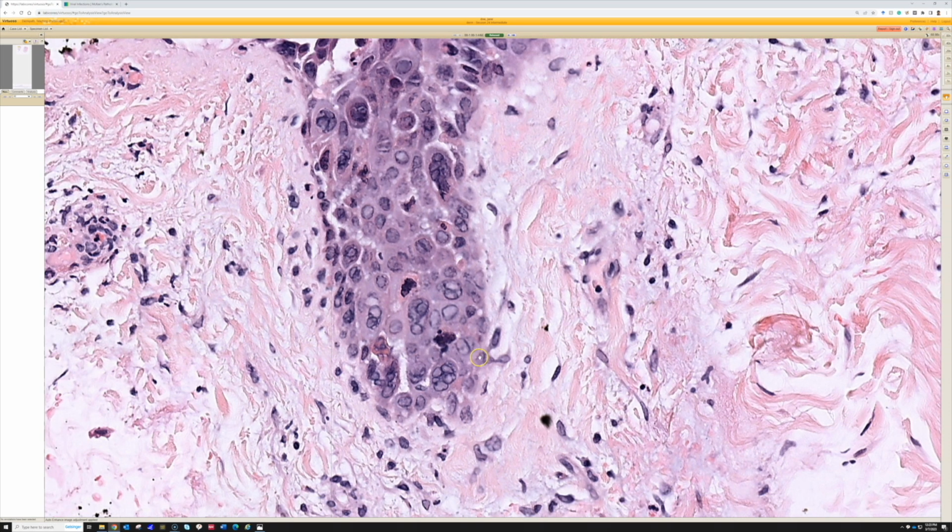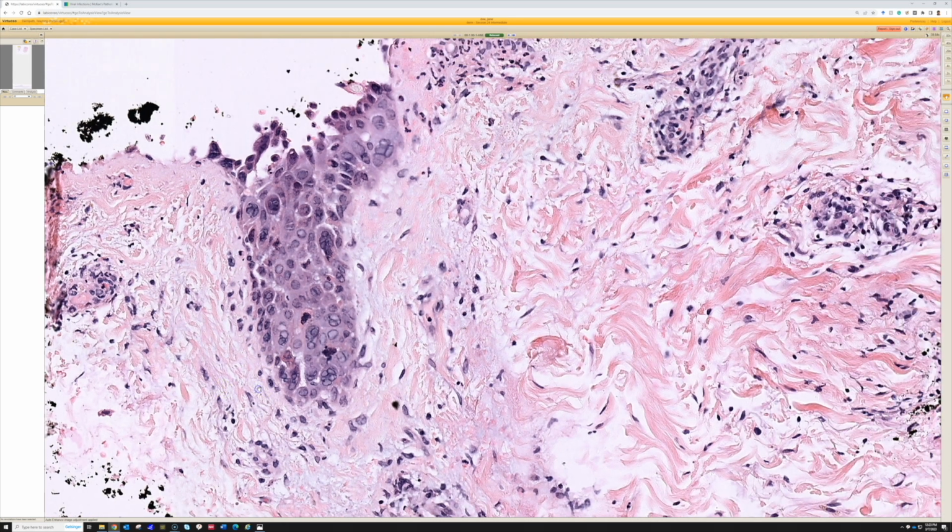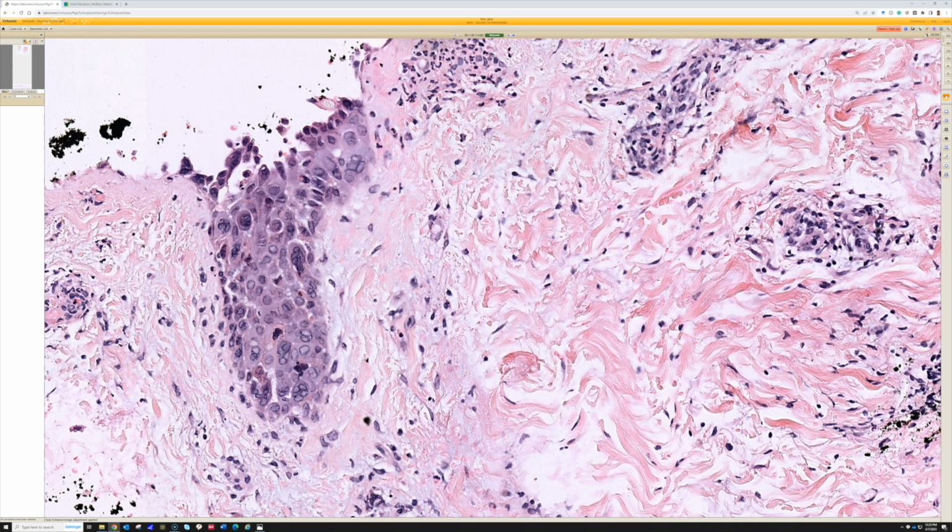One other microscopic clue is if you have a lot of hair follicle involvement, that tends to be more common in varicella zoster. And one thought for that is that in zoster, the virus goes and resides in the sensory nerve ganglia, and then when the virus reactivates, it spreads back through sensory nerves along the dermatome, and then some of those nerves, it seems, connect to the root of the hair follicle and allow the virus to first infect the cells there, the keratinocytes in the hair follicle root, and then from there spread up into the epidermis. So that's why we tend to see herpes folliculitis or follicular involvement by herpes more often in zoster than in simplex.